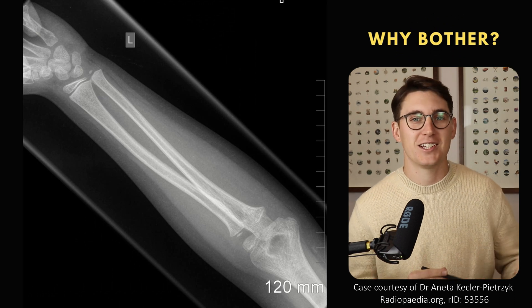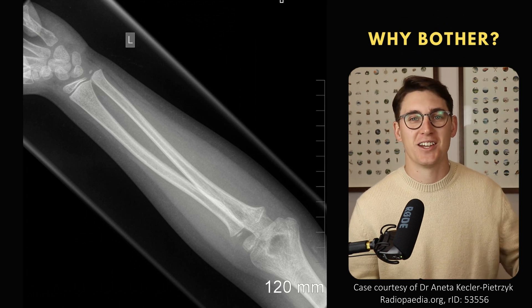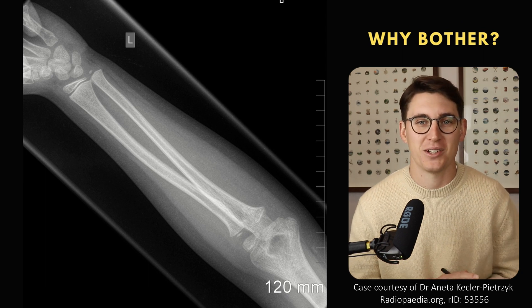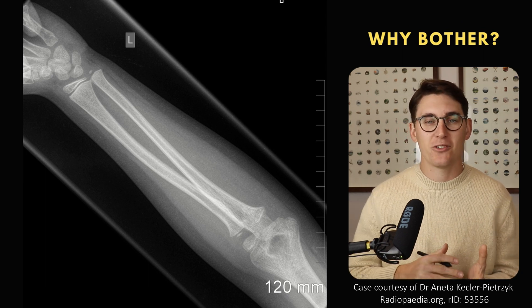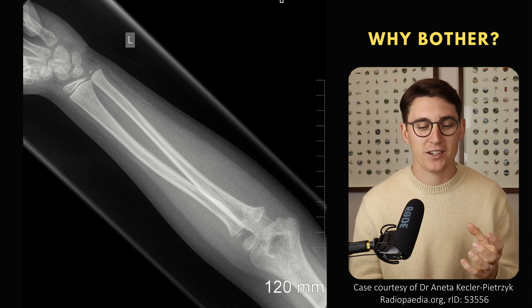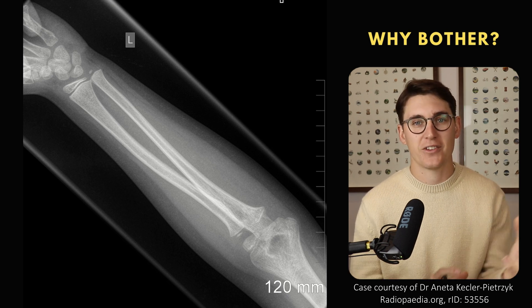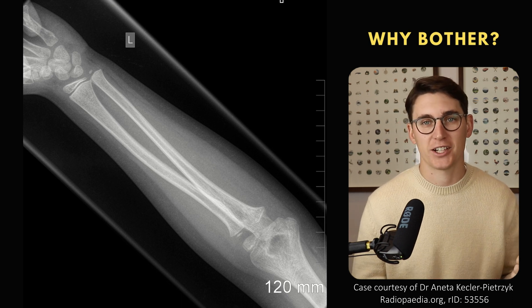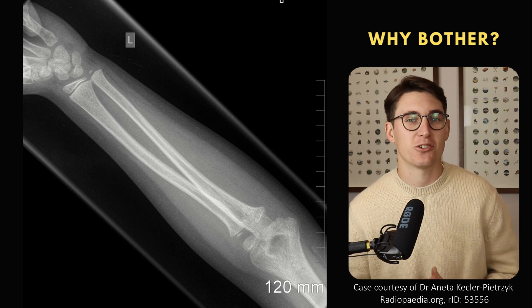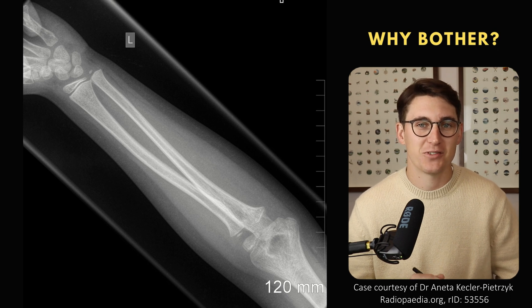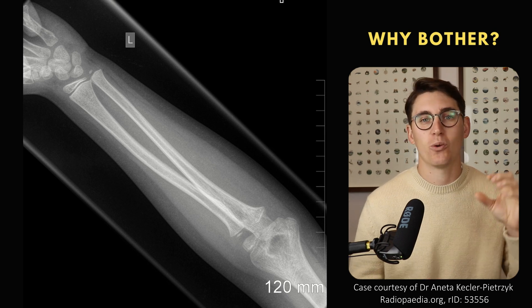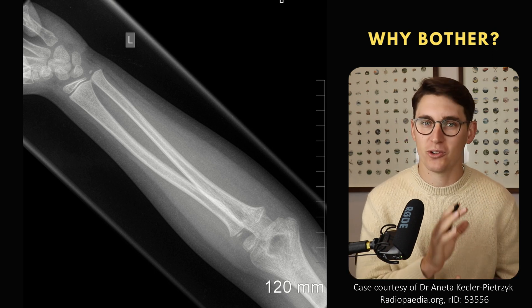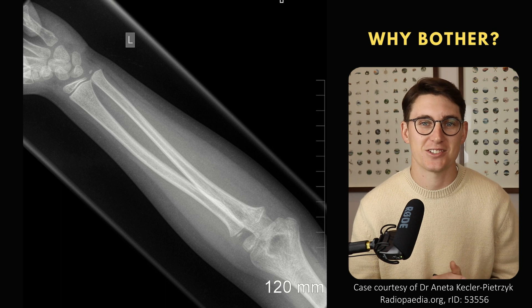Now why do we even bother learning these ossification centers? It's not just for exams or to show off to colleagues. The main reason we learn these ossification centers is because when children fracture around the elbow joint, many of the ossification centers can look like fractures, and avulsion sections of bones can look like ossification centers. If we know the order that those ossification centers appear, we can confidently say yes this is a fracture, or no this is actually an ossification center.